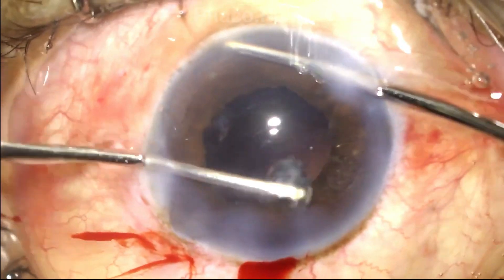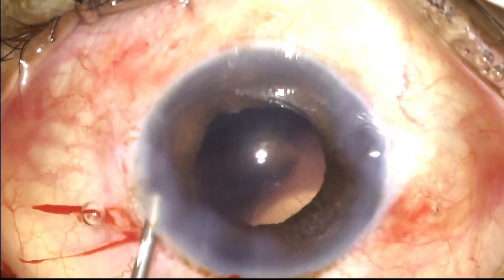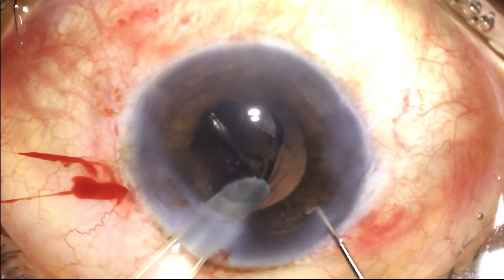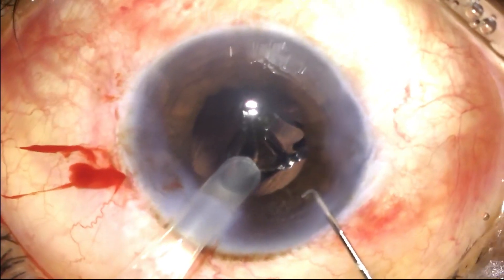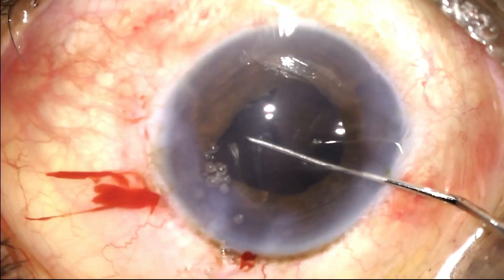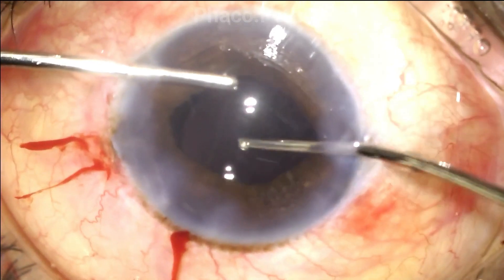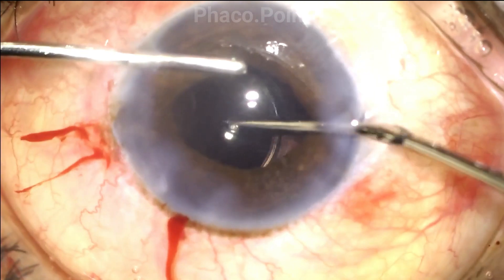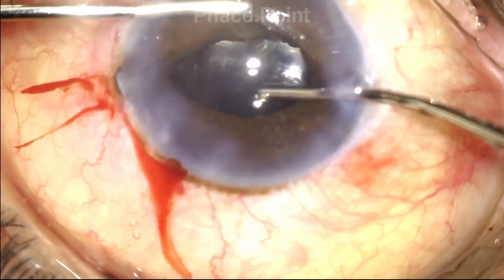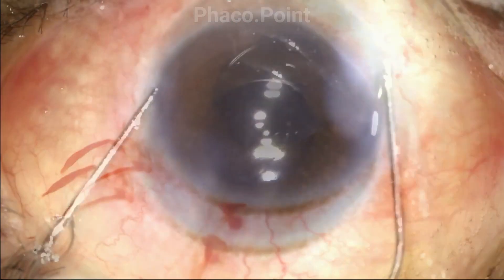At the end of irrigation aspiration, the anterior chamber is refilled and the capsular bag insufflated with viscoelastic, followed by the insertion of a single-piece monofocal IOL within the capsular bag. This is followed by removal of all the excessive viscoelastic from the anterior chamber and around the lens, and finally by a careful stromal hydration.